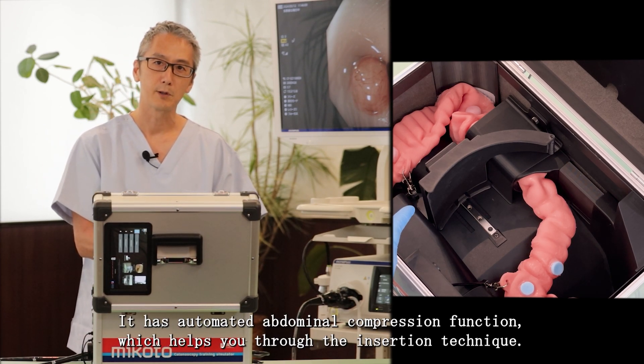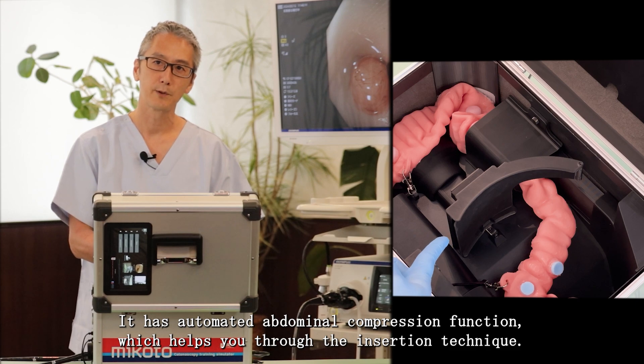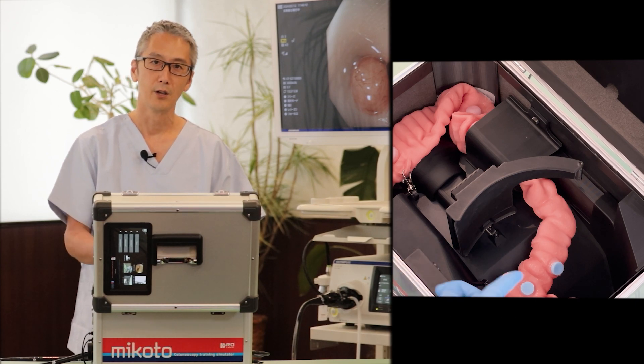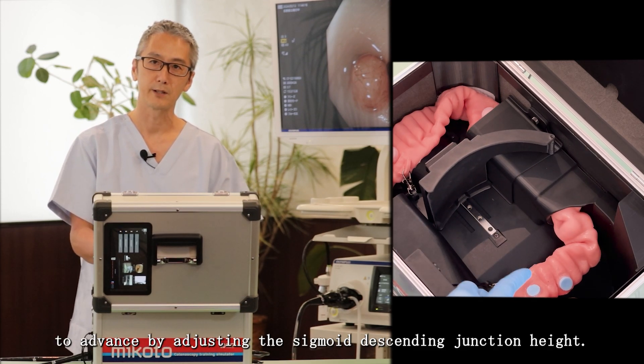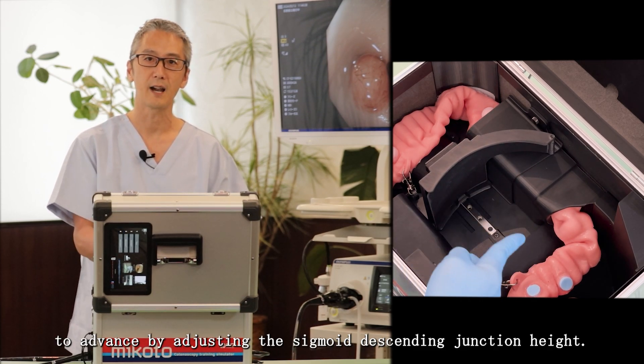It has an automated abdominal compression function which helps you through the insertion technique. You can also adjust the difficulty settings from easy to advanced by adjusting the sigmoid descending junction height.